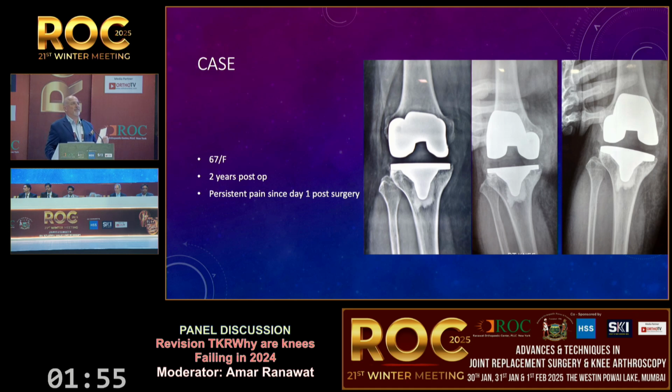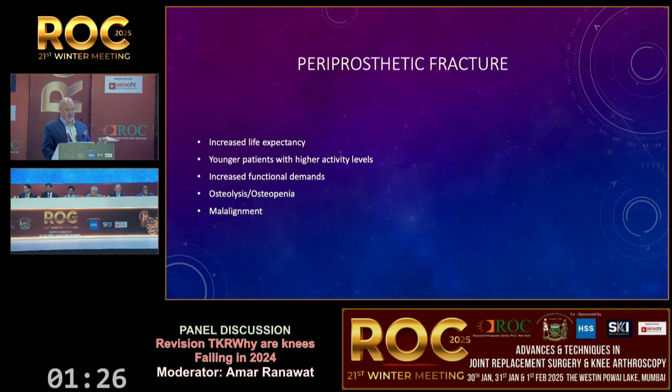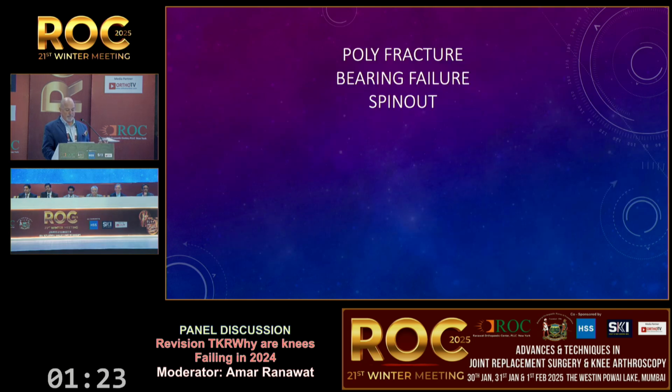I'm not sure the answer of never resurfacing the patella is the right answer, especially if they have severe patellofemoral disease. But I do recognize that if you don't resurface the patella well, it's the beginning of some serious problems. But we can also get things like malrotation. Okay, maybe the robot will fix that. But I just heard a guy say he used the robot and he internally rotated his femur, so I don't know what that robot was thinking. You can get bad cuts, you can get periprosthetic fractures. But a bearing spin out, is that the patient's fault? No, it's our fault, the surgeon's fault, lack of proper balancing, especially the flexion gap.